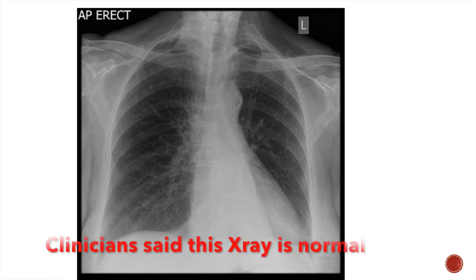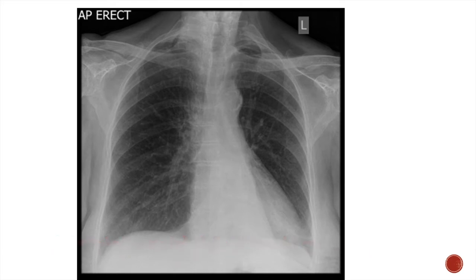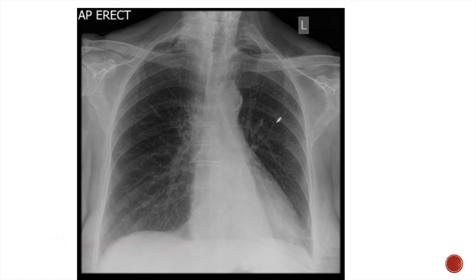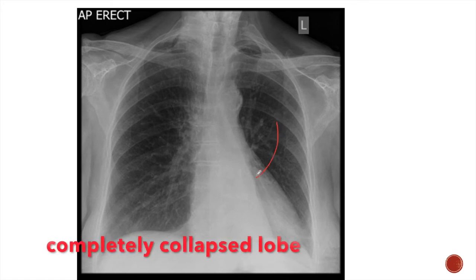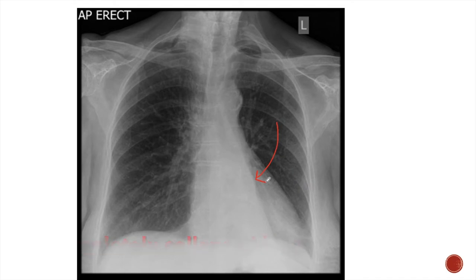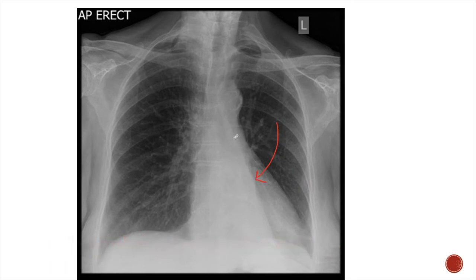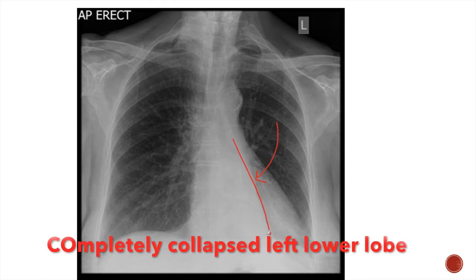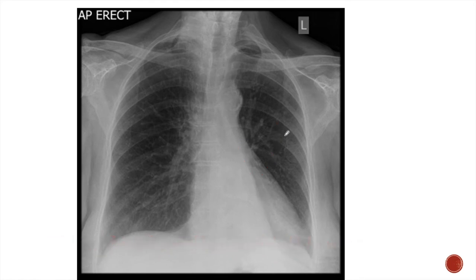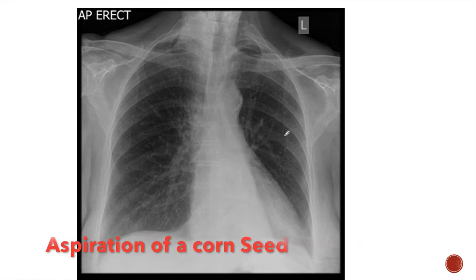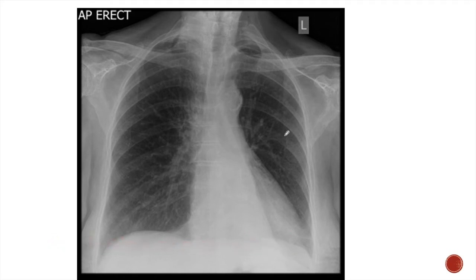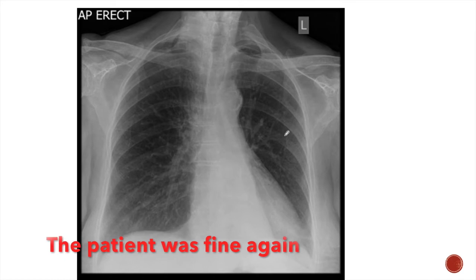The clinician said that this x-ray is normal, but this is not normal. The main confusion in this x-ray was the failure to recognize the presence of a completely collapsed lobe. This triangular retrocardiac opacity represents a completely collapsed left lower lobe. This patient had lower lobe collapse from aspiration of a corn seed. The corn seed was later removed and the patient was fine again.